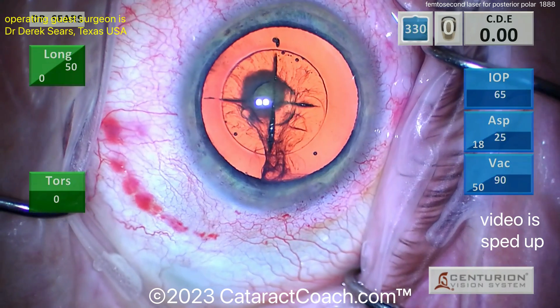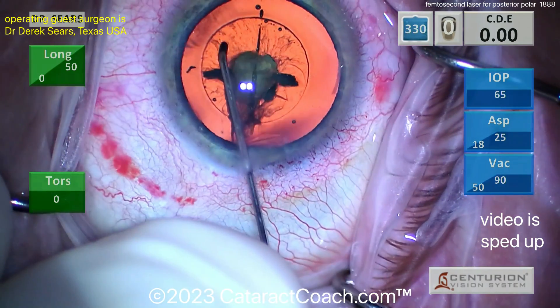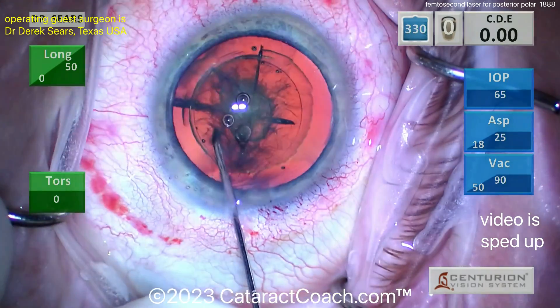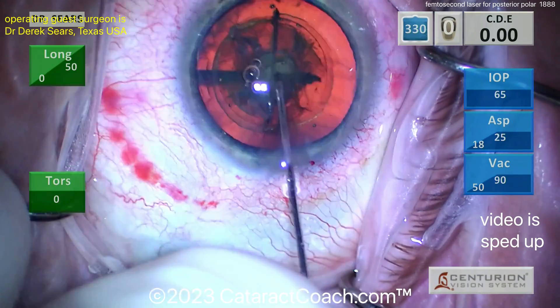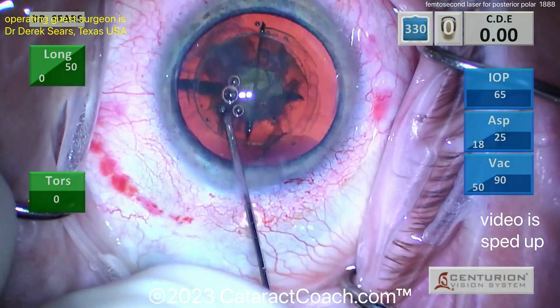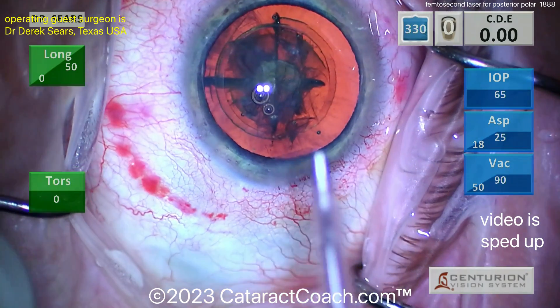No hydrodissection here — just looks like a hydrodelineation. There it is, a little delineation. Get that central endonucleus up and out, very nicely done. Be very cautious — you don't want hydrodissection because that can split that posterior polar cataract.